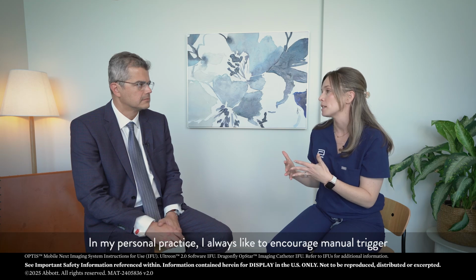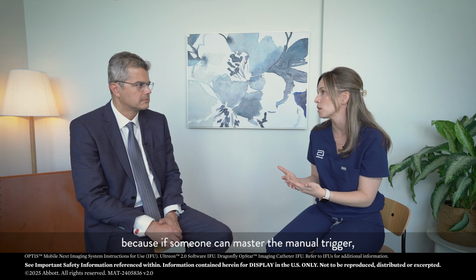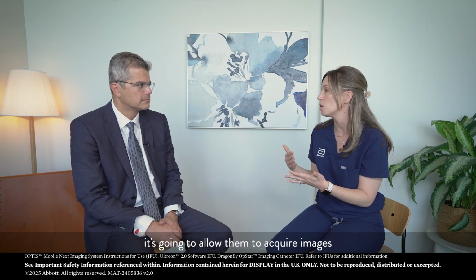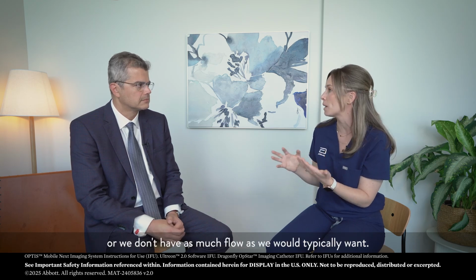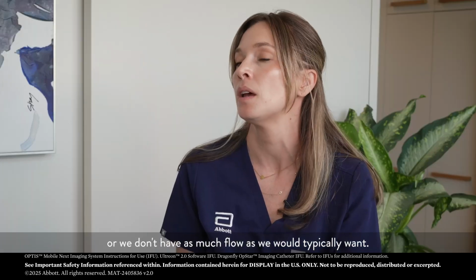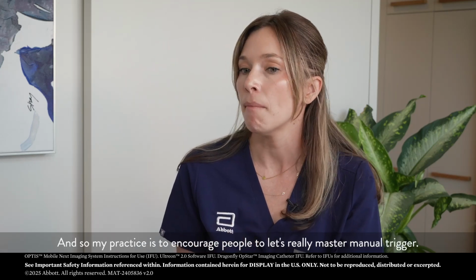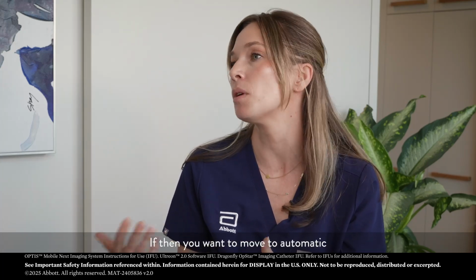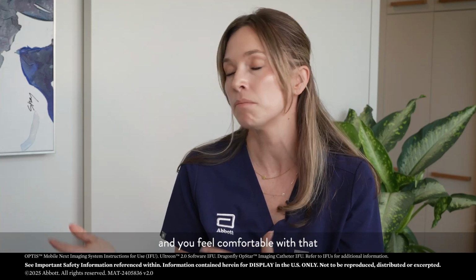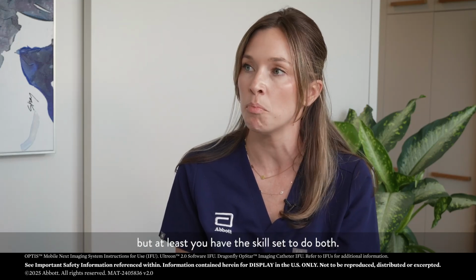In my personal practice, I always like to encourage manual trigger because if someone can master the manual trigger, it's going to allow them to acquire images in maybe some anatomical situations that are a little bit trickier or where we don't have as much flow as we would typically want. And typically I find that the image quality is better. So my practice is to encourage people to let's really master manual trigger. If then you want to move to automatic and you feel comfortable with that, great, move to automatic. The software will pull back for you when it senses the right amount of blood clearance, but at least you have the skill set to do both.